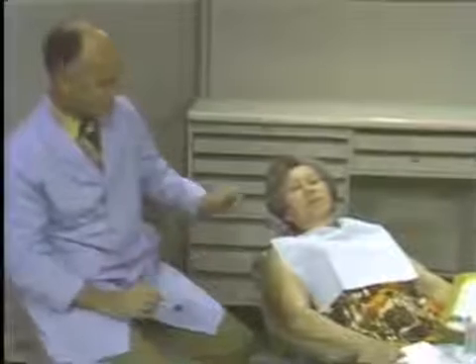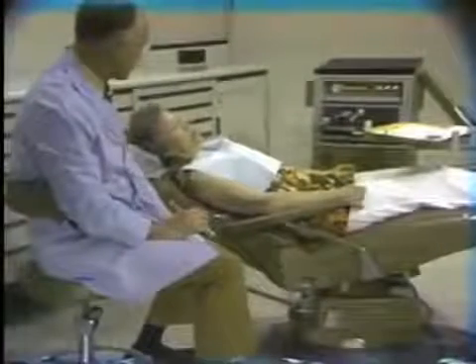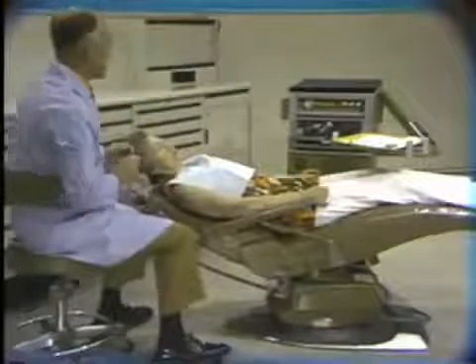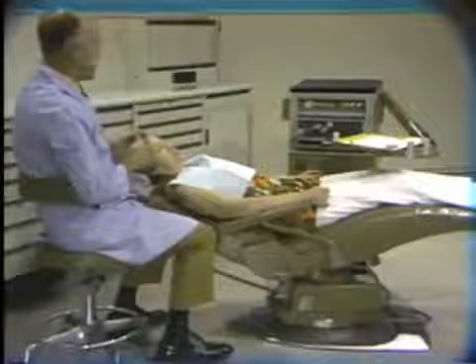Now to the mandibular left quadrant. The chair is nearly in that position now. We will lower the back to about plus 25 degrees. The tilt is still at horizontal. The footrest is horizontal to the floor. And we're ready to assume this position for operating in the lower left arch.